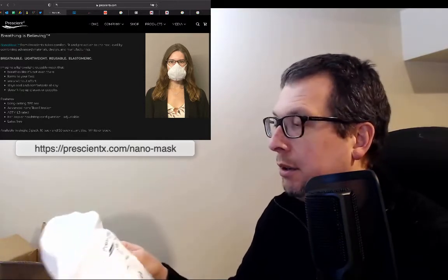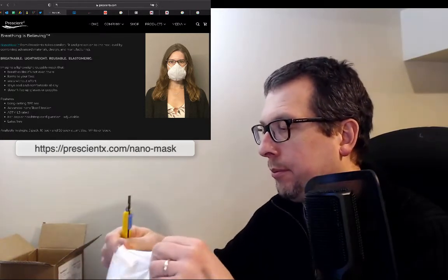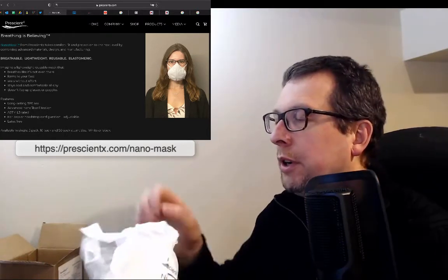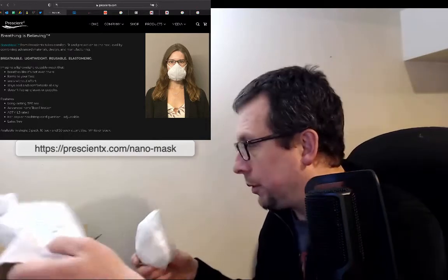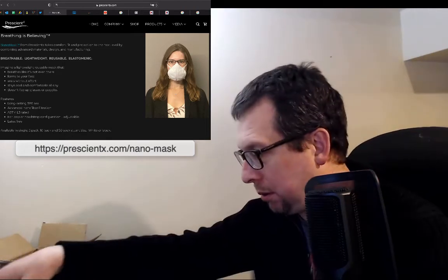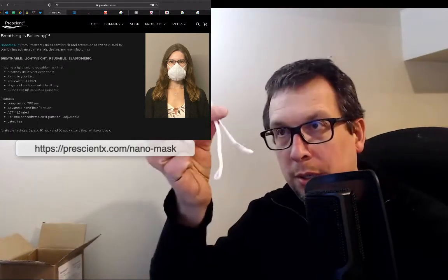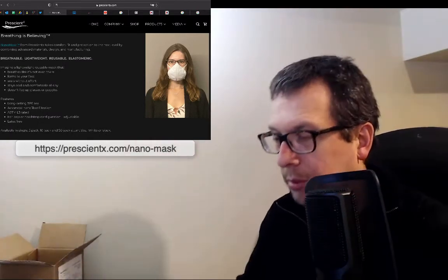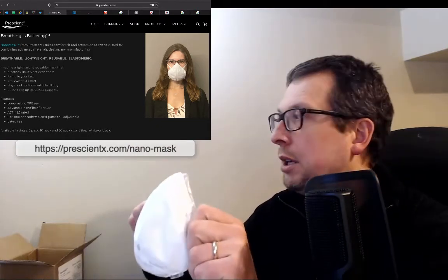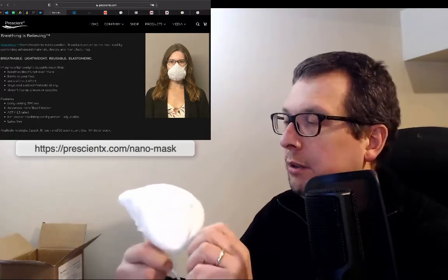Here comes a little bag — let's open it up. There's one ear loop, there's the other ear loop. And here is the mask. It's got a really nice, soft elastomeric seal on it.